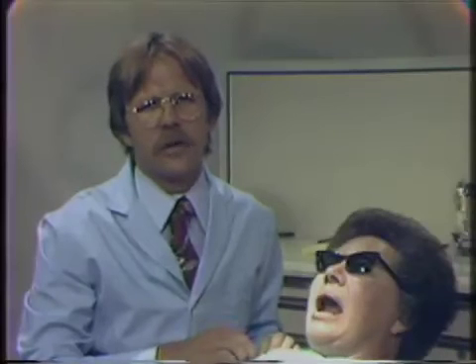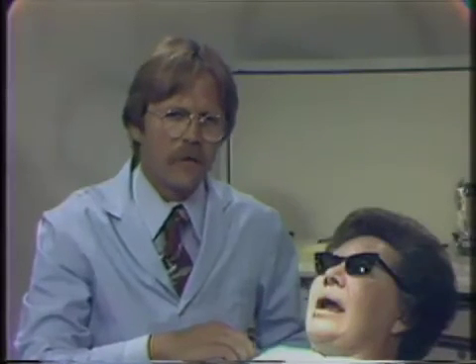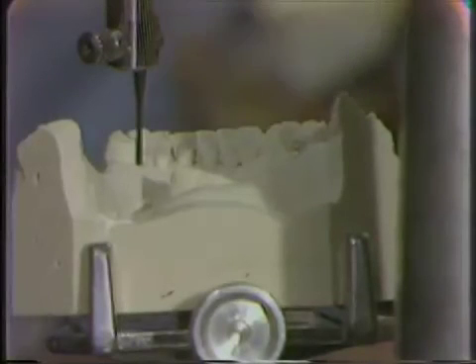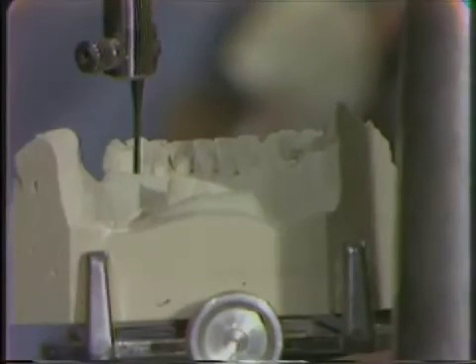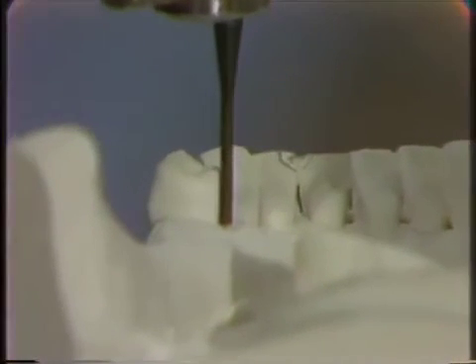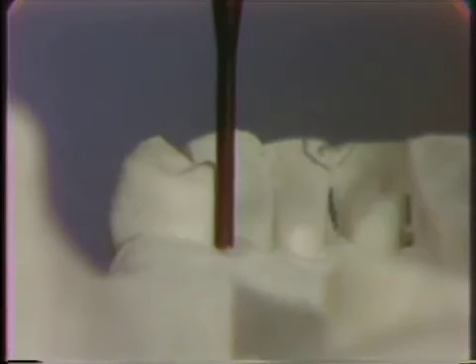So we're going to make an alginate impression of the mouth, pour it up in a half impression plaster, half stone, improved stone mixture so that it will set up rather quickly. Then, by the use of our tripodization, we'll place the new cast on the surveyor to double check the parallel-shaped surface that we have ground in the mouth. This impression plaster-stone cast has been tripoded and placed on the surveyor to the same position that the initial diagnostic casts were placed when the correct path of insertion was chosen. We can see that the disking with the stone that we have done is adequate — we do have a parallel surface on the lingual of the bicuspid at the greatest diameter of the tooth, opposite our proposed retentive area.